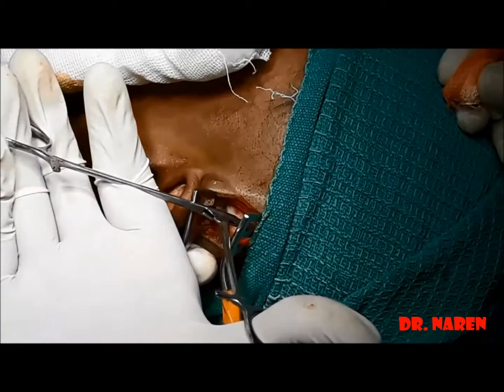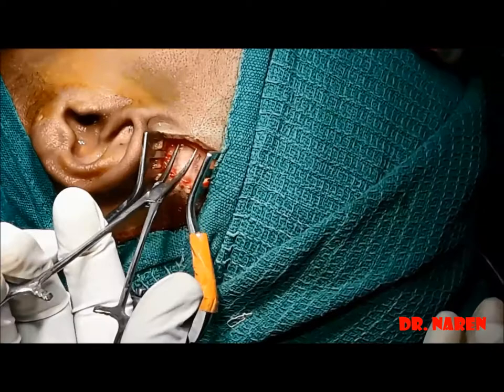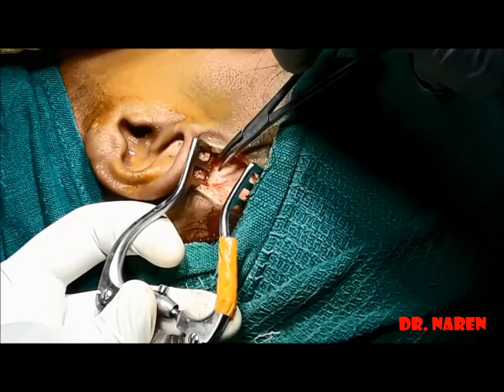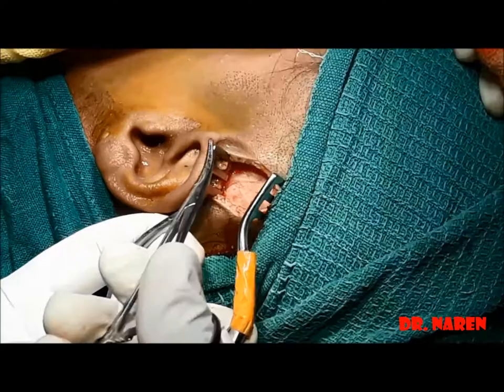The next layer to the superficial layer is the deep layer of temporal fascia, which is our area of interest. It is very strong and is also called the lamina profunda. It is aponeurotic and has a clear arrangement of fibers, which makes it good for reconstruction of the tympanic membrane. The white clear fascia is what we are going to dissect now.